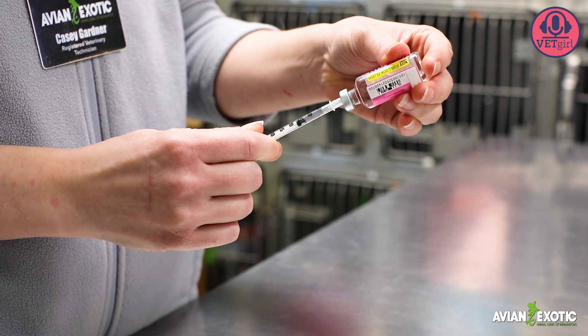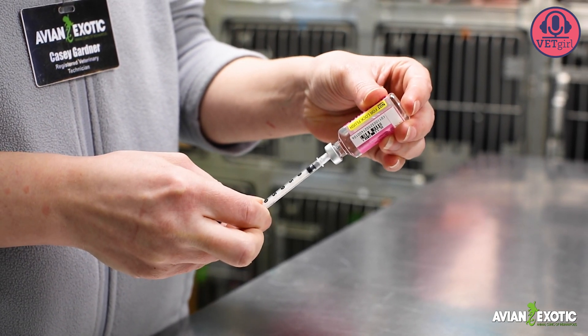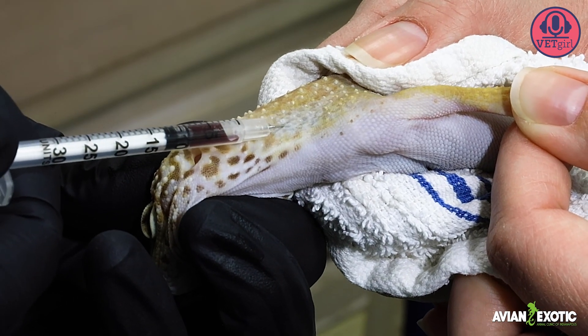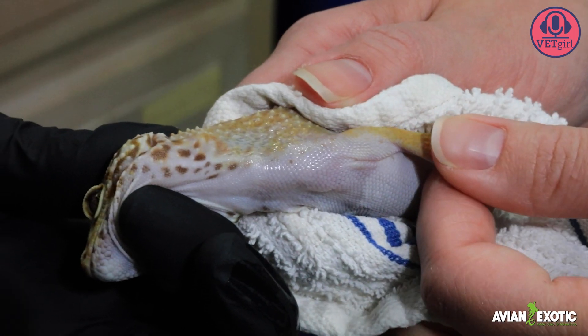Heparinize a 1ml syringe with a 27-gauge needle or an insulin syringe. The assistant positions the lizard laterally and controls the body and forelimbs. Carefully grasp the top of the head and below the jaw.